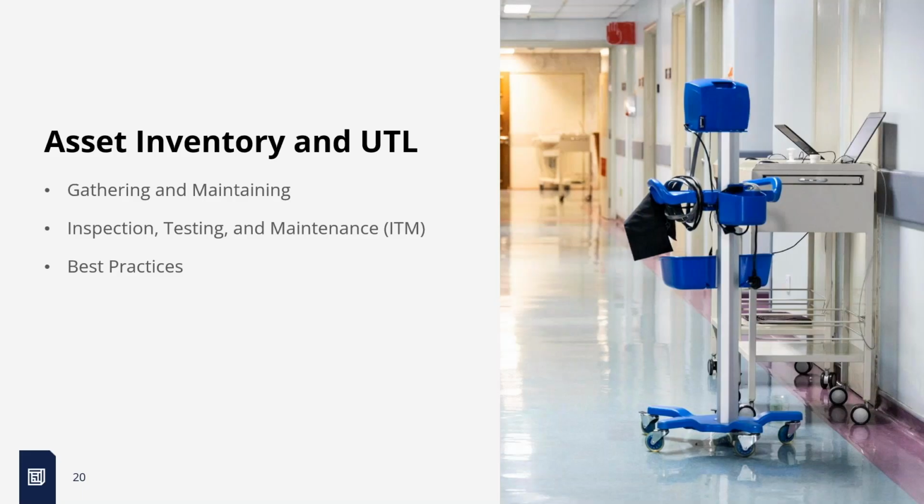There's a term that's making its way large on the facility side. It's making its way into some of the code language as well. It's ITM. A lot of people are used to the word PM, preventive maintenance, but it's inspection, testing, and maintenance. A lot of the time you're inspecting it, you're testing the piece, you're not really performing maintenance on it. So that's some of the terminology you're going to see in this presentation, and some other things as well. Like HTM, which was a relatively new term. It was biomed. Some people are still like, we're biomeds, we're not HTM, or clinical engineering.